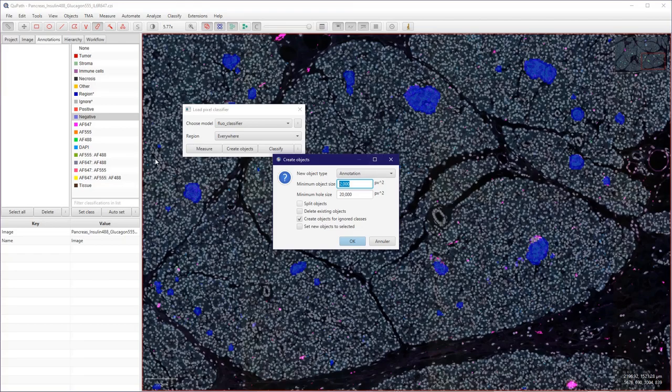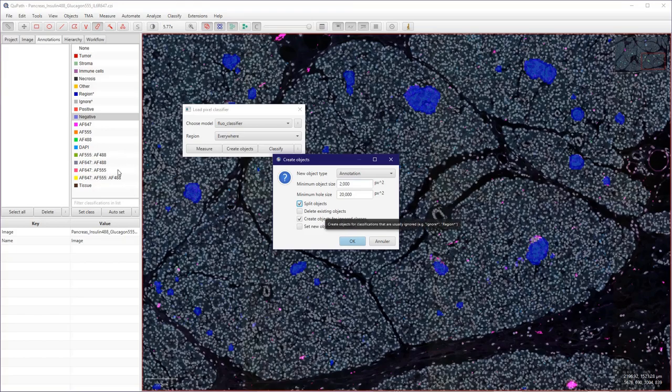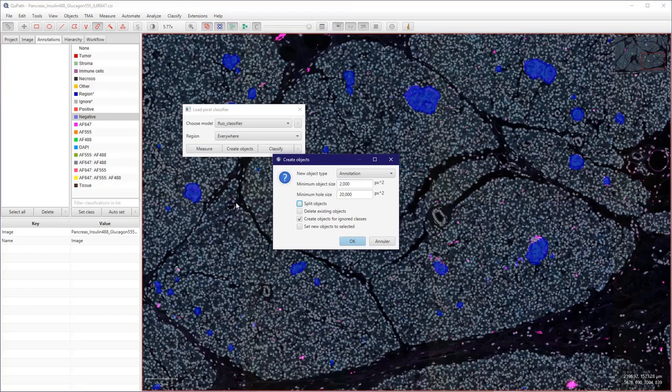I can directly split the objects there but I will do that maybe in a second part, just to get a bit more lines in my script. But you could do that at this step here.